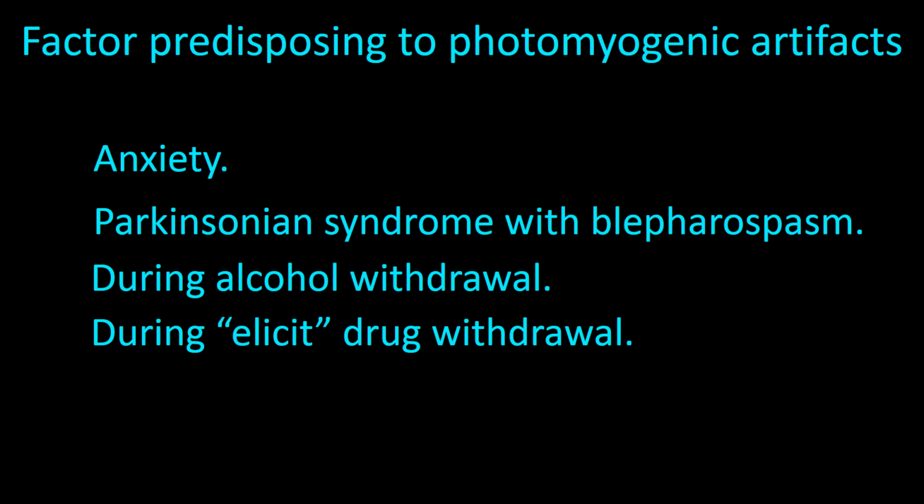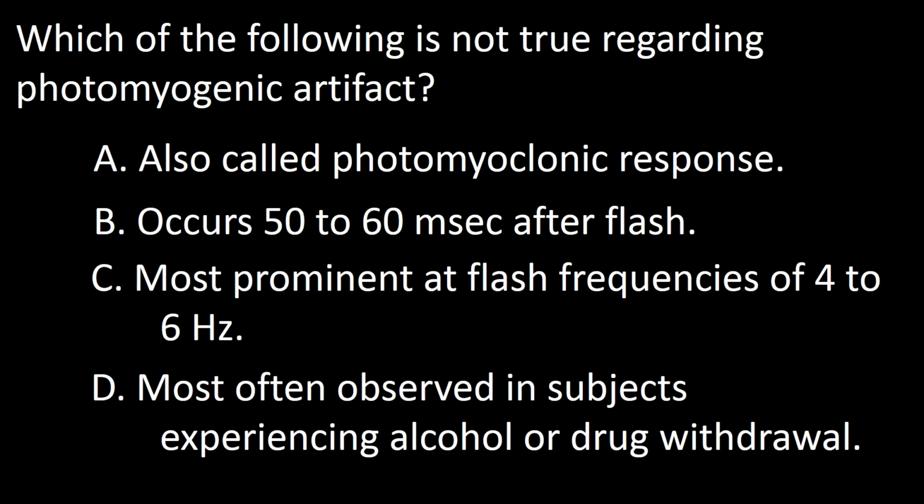Photomyogenic artifacts most often are observed in subjects with anxiety, Parkinsonian syndromes with blepharospasm, and those experiencing alcohol or drug withdrawal. So the answer to this question is C.